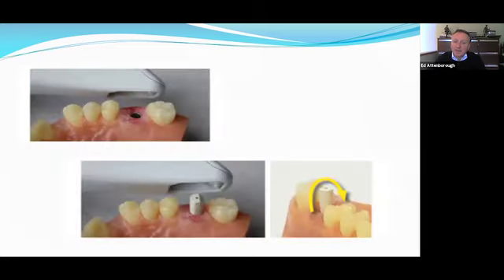The other point to bear in mind is implant work, and obviously we talked about whether or not you can see a subgingival prep, and intraoral optical scanners can only record what they can see. The way it works with implant workflows is that you use something called scan bodies, which are like little reflective abutments made out of PEEK, which engage with the fixture head and have a known shape on the top. In this case, a little flat on the side there.